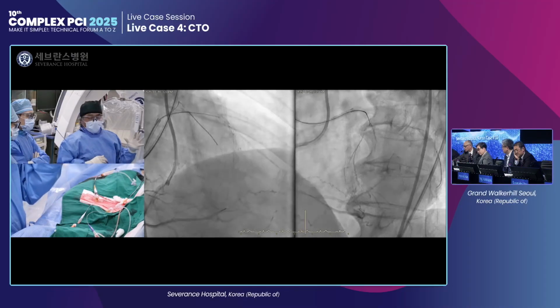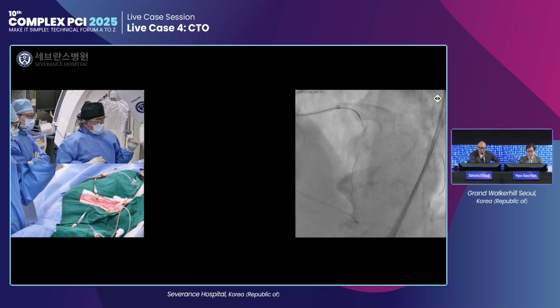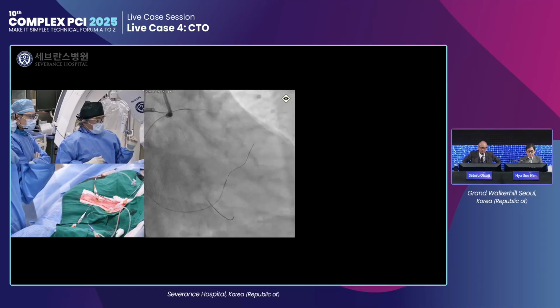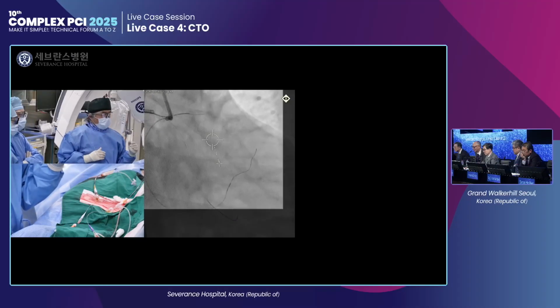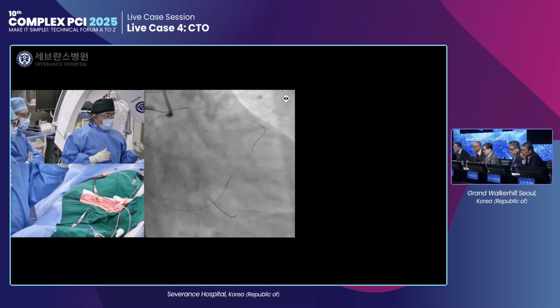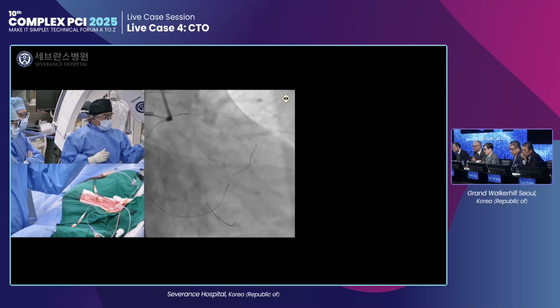Dr. Kao, do you need hemostasis by straw? Do you need hemostasis with this perforation by straw? Yeah, I will apply negative pressure on this microcatheter. But he already has the wire into the LAD. Maybe the perforation site is covered by the microcatheter.